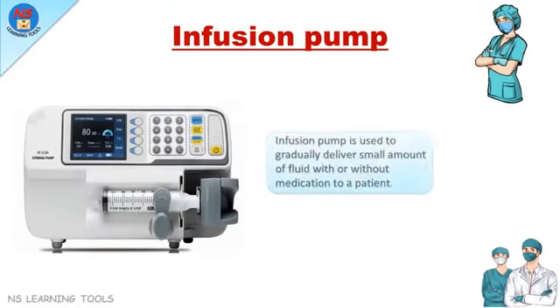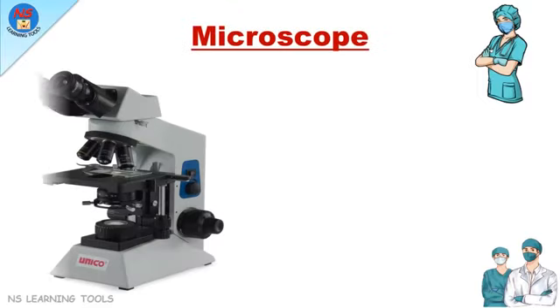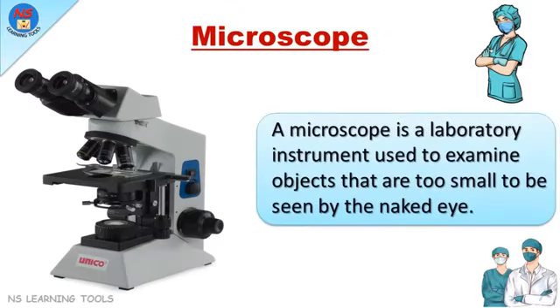Infusion pump. Infusion pump is used to gradually deliver small amount of fluid with or without medication to a patient. Microscope. A microscope is a laboratory instrument used to examine objects that are too small to be seen by the naked eye.